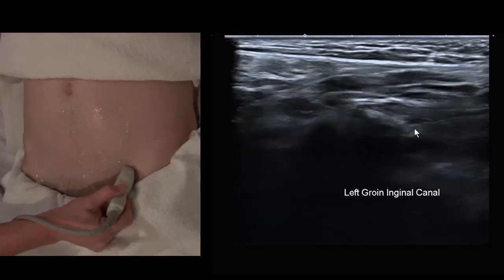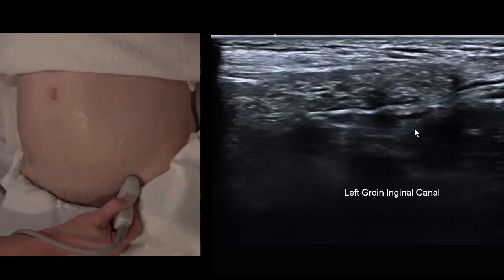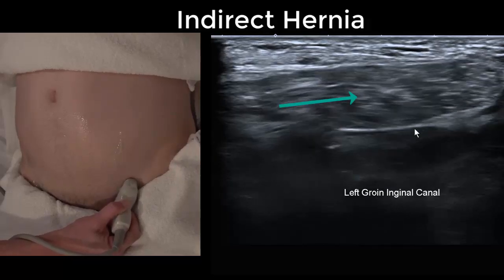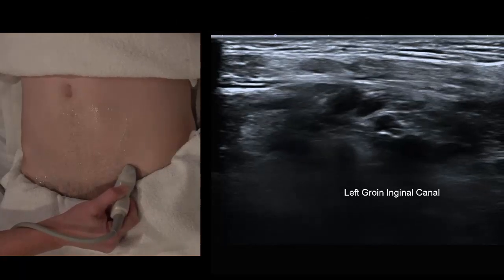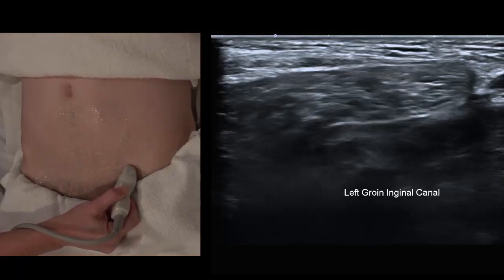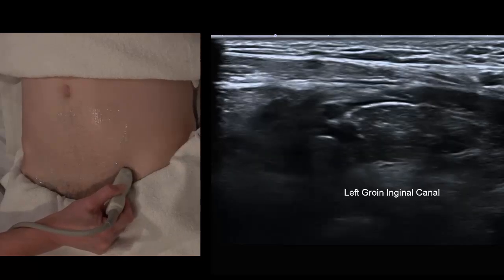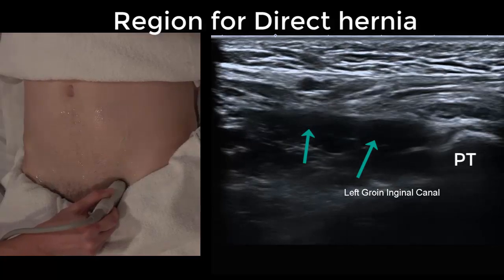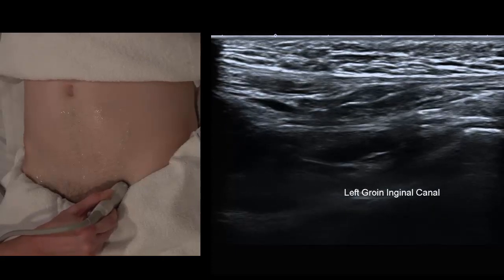Back into longitudinal: we can see the deep ring to the left and something sliding from left to right across the screen. That makes this an indirect hernia because it's using the deep ring as its entrance point. Normally the deep ring should have obliterated in a young male by birth or by two years of age. If it stays open we call that a congenital hernia — meaning they didn't acquire the hernia through life. Direct hernias that bust through the posterior wall region are more likely acquired through work or physical activity.